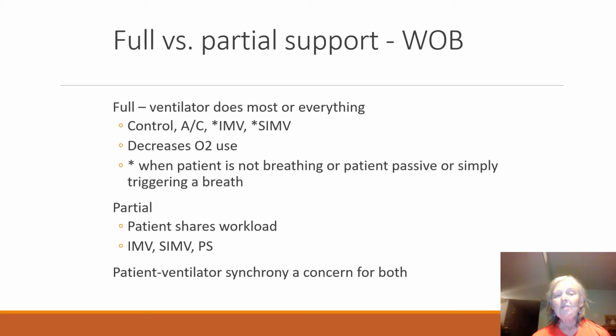Partial support, the patient's going to share that workload. This is where you see IMV, SIMV, a little bit with pressure support. Can you have an increased oxygen usage in this mode with partial support? Yes, you can. If you have a patient who is trying to fit 20 breaths in between two mandatory breaths, that's a high respiratory rate on their part. That's a lot of work. And so we need to make sure that we go in there and try to keep that patient as comfortable and sedated so that we don't have problems with it.